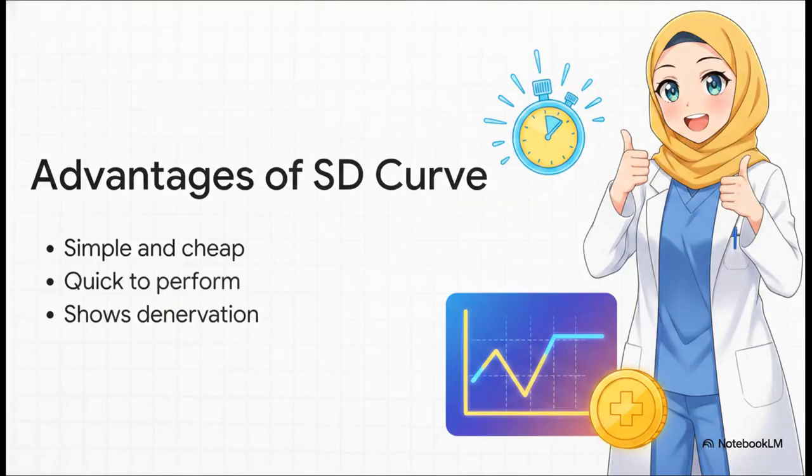Finally, let's wrap up with Section 6, Pros and Cons. Clinicians absolutely love this test for several distinct advantages, which we've laid out in these bullet points here. First off, it is simple, reliable, and cheap. Second, it is incredibly quick and easy to perform. Third, it clearly indicates the exact proportion of denervation based on the depth of the kink we just saw. And finally, it requires very minimal training to actually plot out the graph.